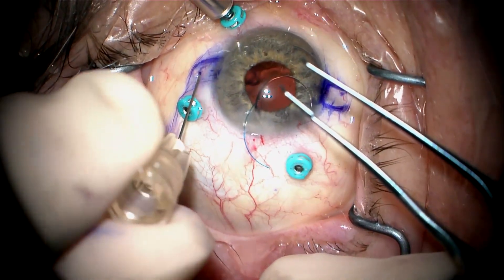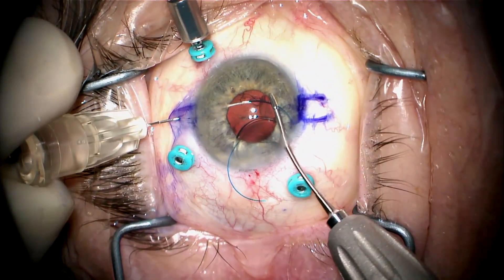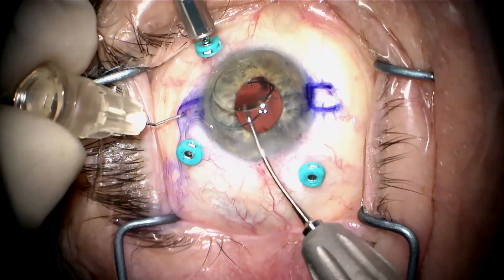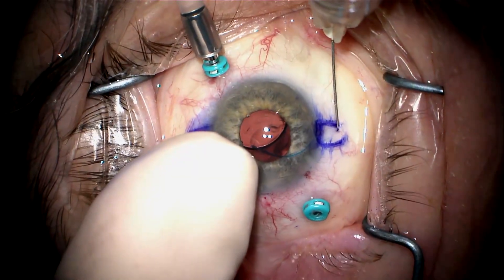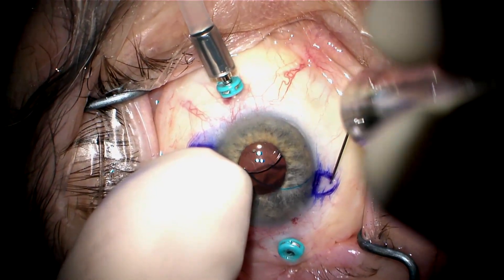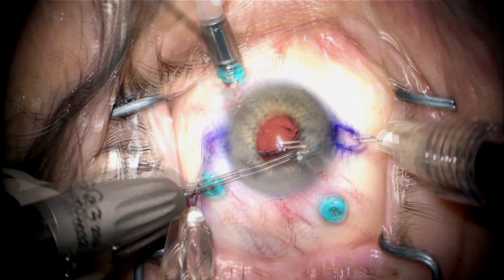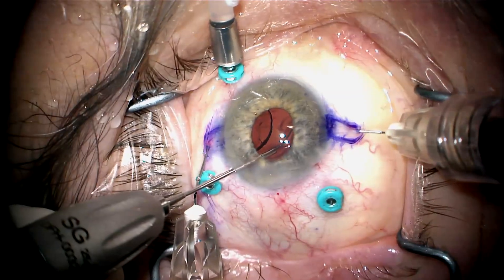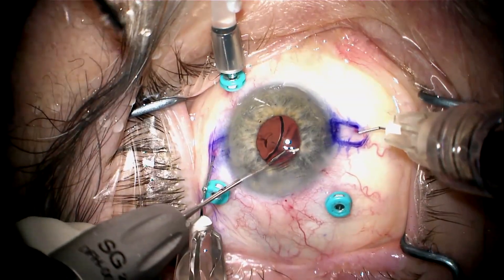I turn the infusion back on and do my first needle pass with my TSK needle. I put the haptic into the lumen of the needle about 3 millimeters, then let go of this needle after I push the second haptic into the anterior chamber. I can now focus on the second needle pass using a 30-gauge needle, making a fairly long pass because the sclera will be a little thin on this 29-millimeter eye. I use the needle to push the optic away so I can grab the tip of the haptic about 3 millimeters back, then guide it into my 30-gauge needle, being very careful not to crimp or damage the haptic.